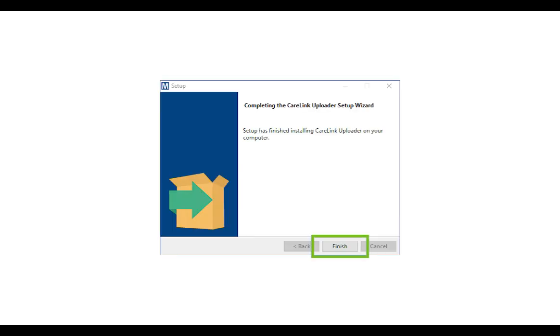When the installation has completed, select Finish. See our additional instructions on how to upload and review your reports.